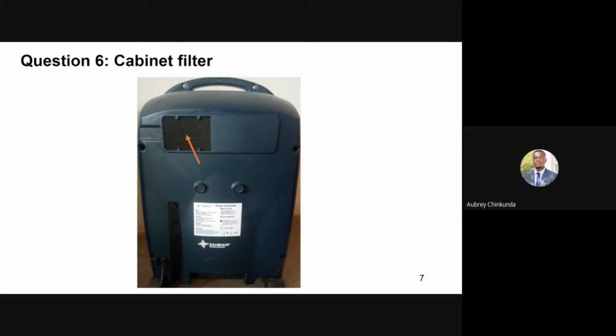In addition, the cabinet filter should also be cleaned with water on a regular basis, as it was told in the topic of interest, in order to keep the concentrator running properly and have it produce oxygen purity that is within the recommended levels. And if there is need to keep the concentrator running while the filter is being cleaned, make sure that a spare filter is available and it is used. It is recommended that the cabinet filter be cleaned weekly with soapy water and left to dry before it is put back on the concentrator.